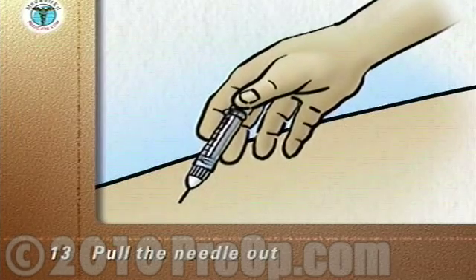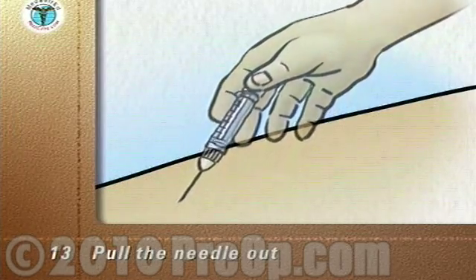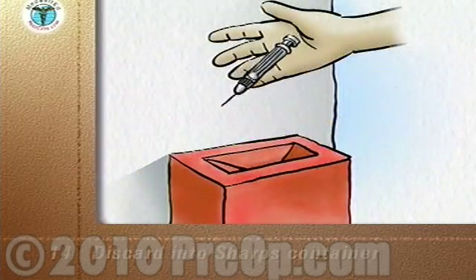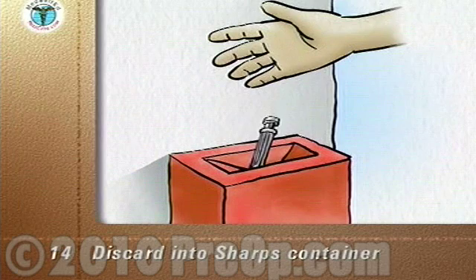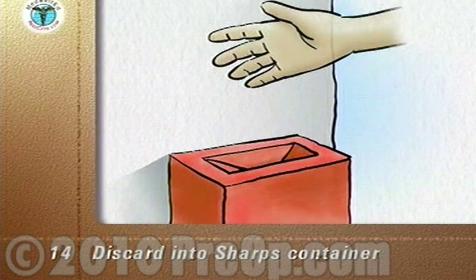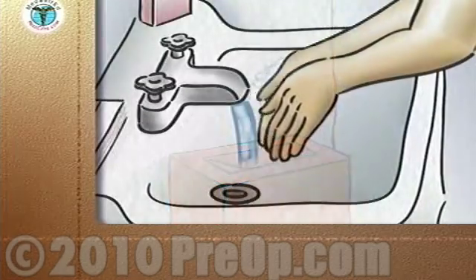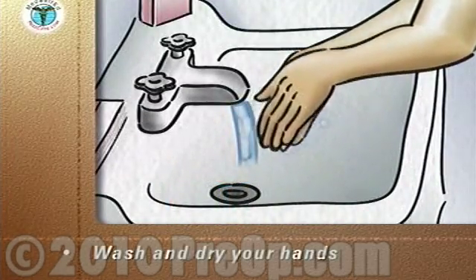There's no need to use a Band-Aid unless blood appears at the injection site. Discard the syringe and attached needle into your puncture-proof sharps container. Do not recap the needle. Wash and dry your hands.